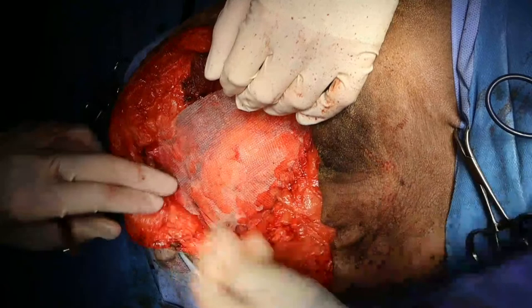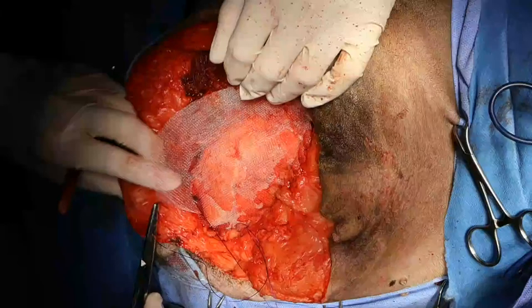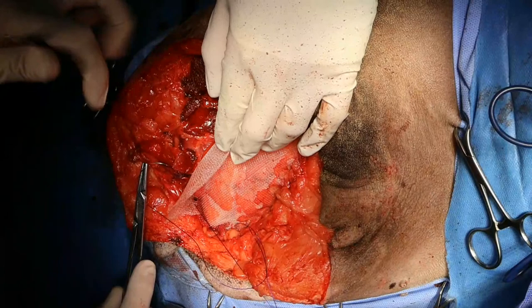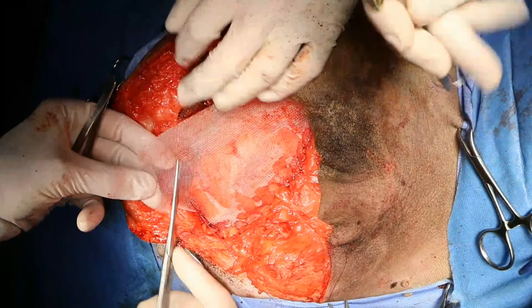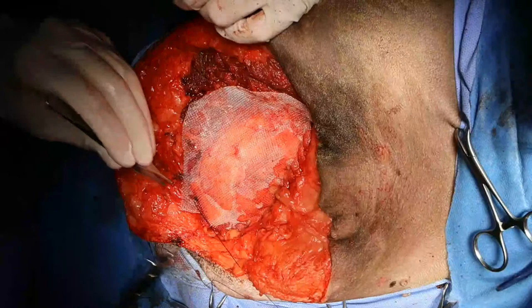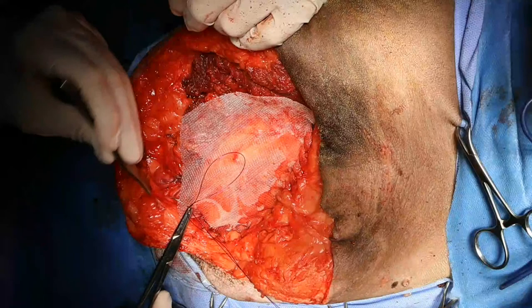To up here, so that's colon right there. I can't really suture to that. Got some muscle here. I might trim a bit more of that off back here. Basically, I'm just going to come back to connective tissue here.